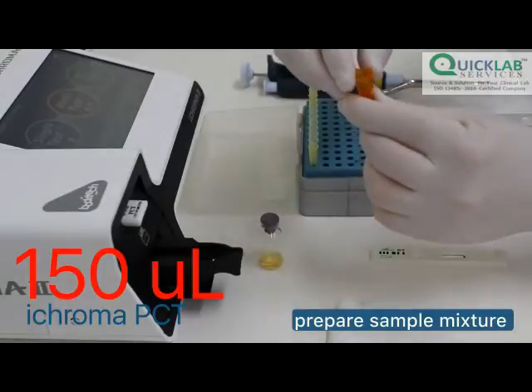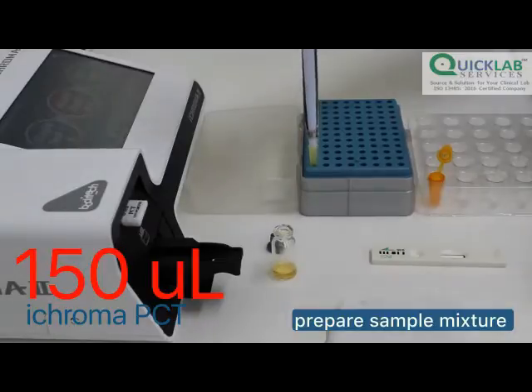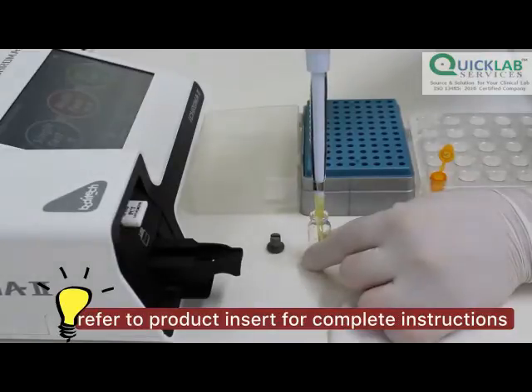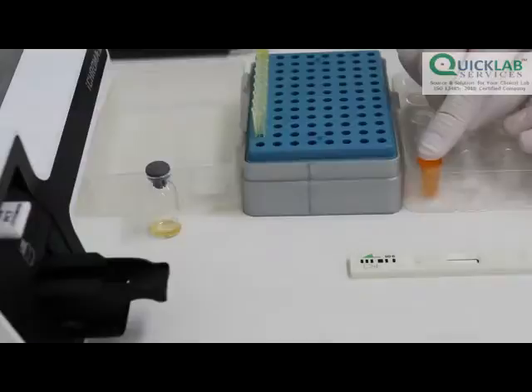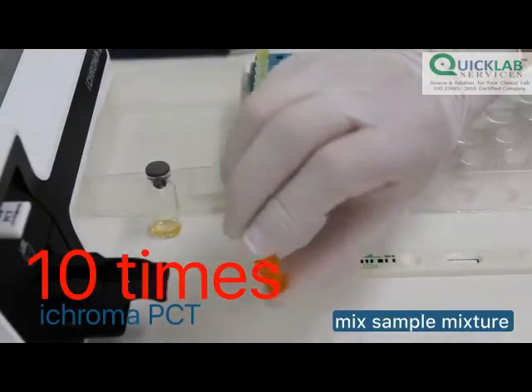Transfer 150 microliters of the sample using a pipette into the detection buffer tube. Close the lid of the detection buffer tube and mix it by inversion 10 times.